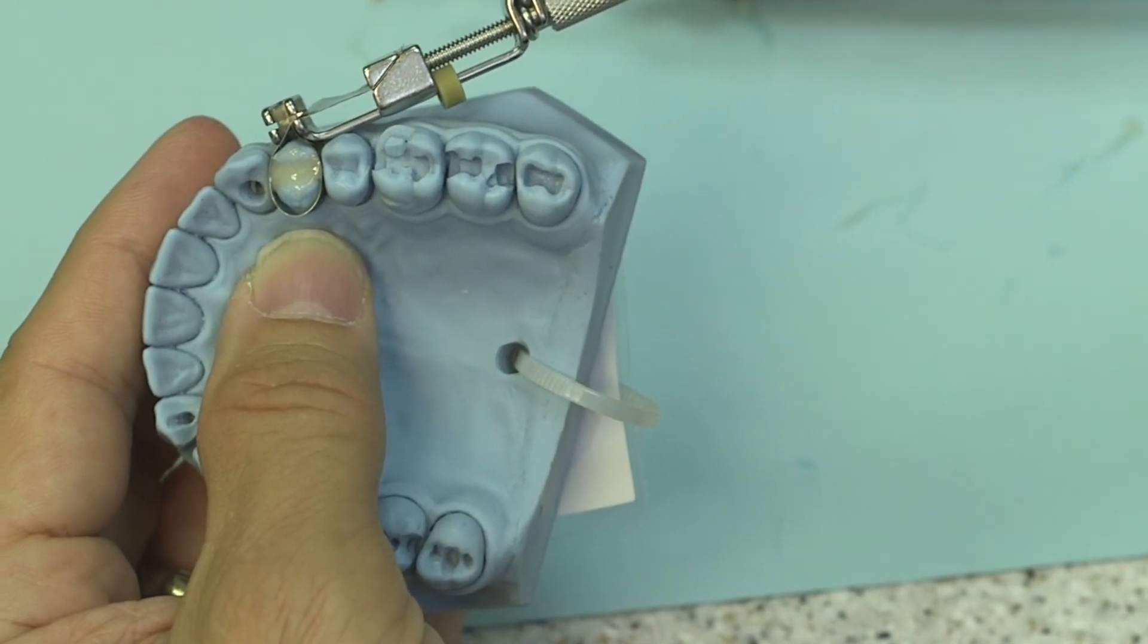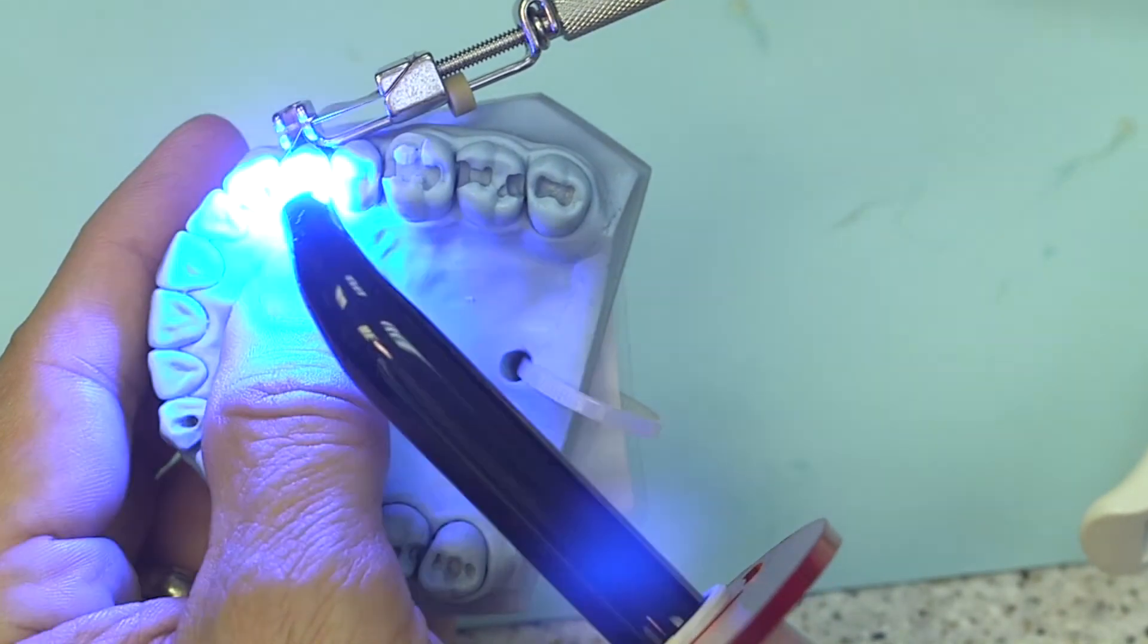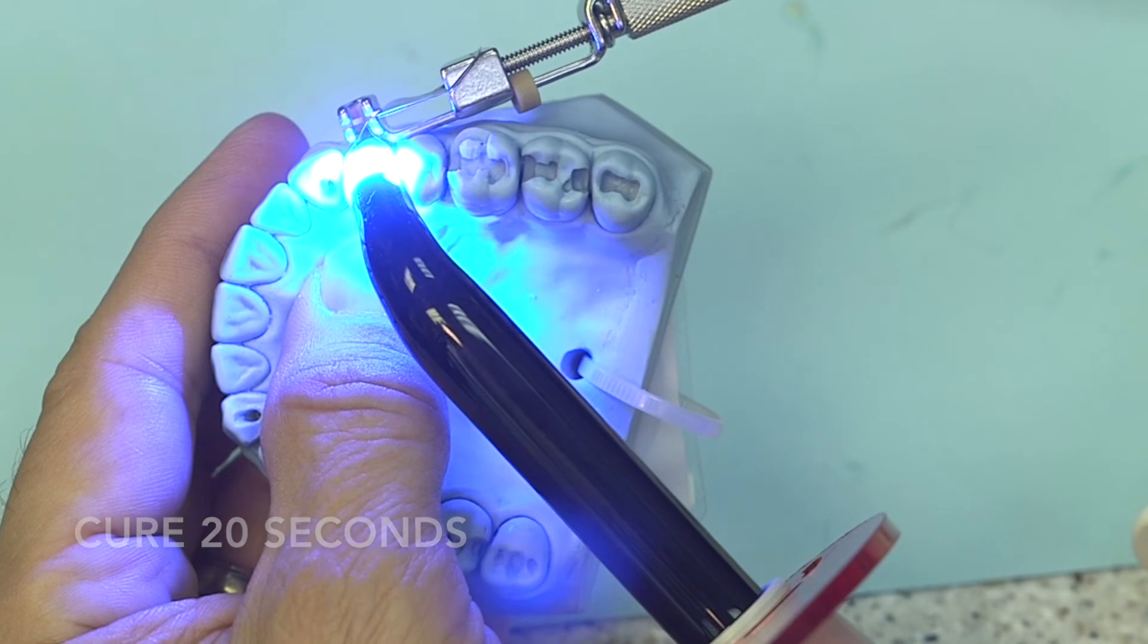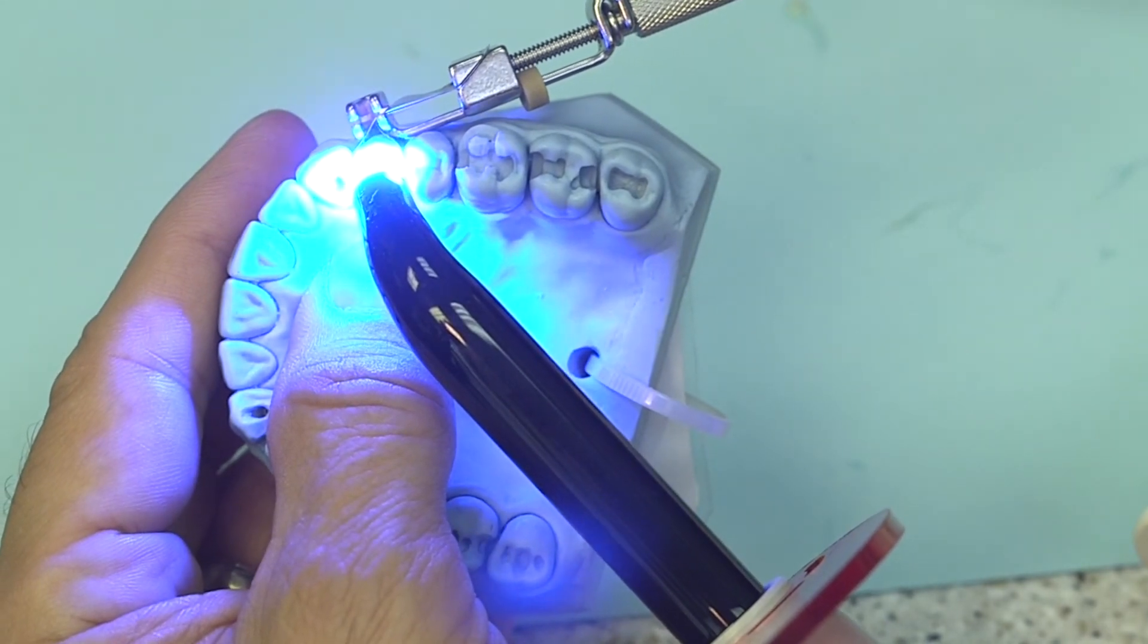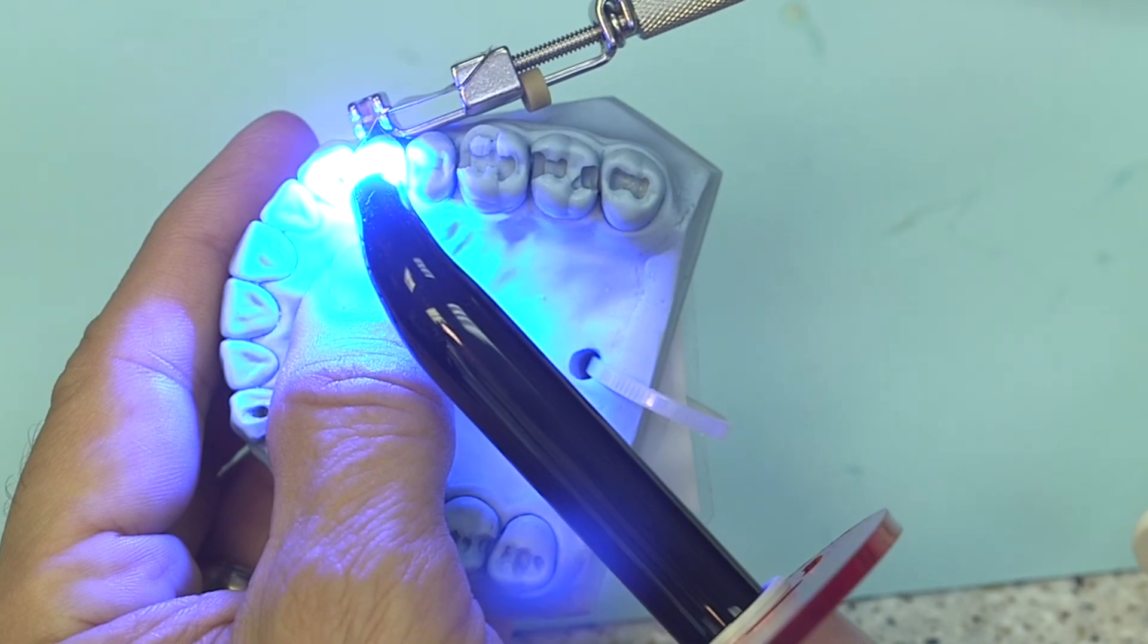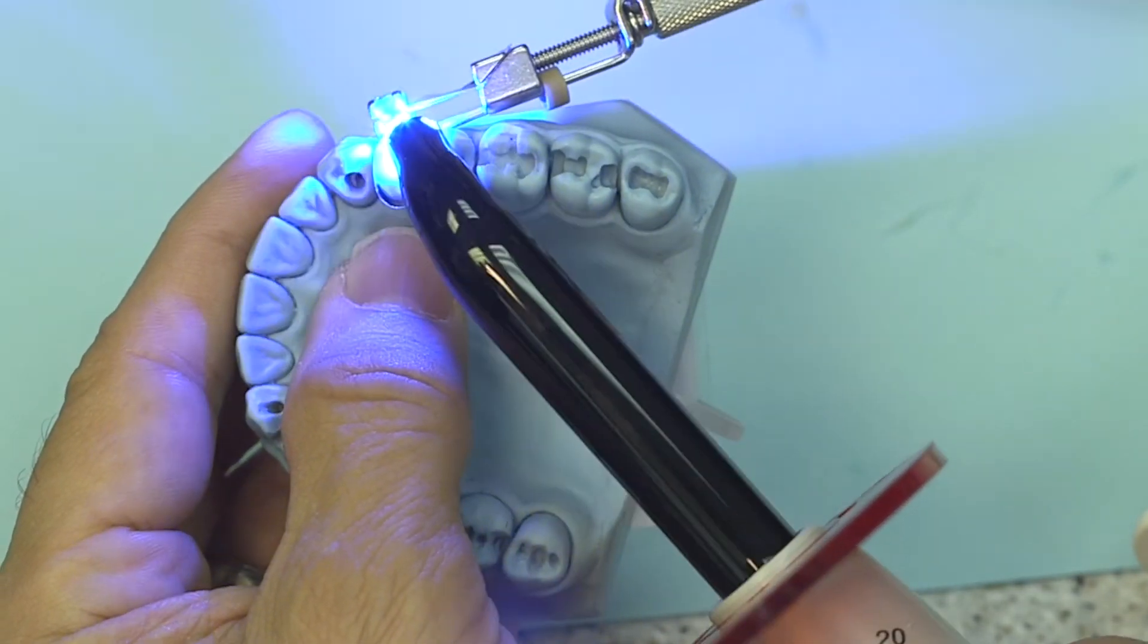Okay, wait just a little bit, not rushing through the entire procedure, and now I'm going to go ahead and cure that. After that's cured we'll remove the matrix band and I'll show you how well we did, approximately hopefully as good as I typically try to do of course. We're almost done with the cure.